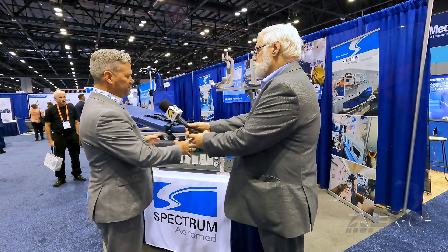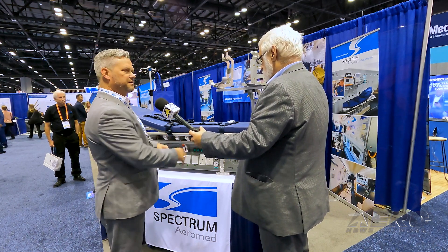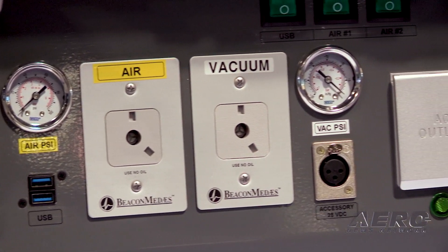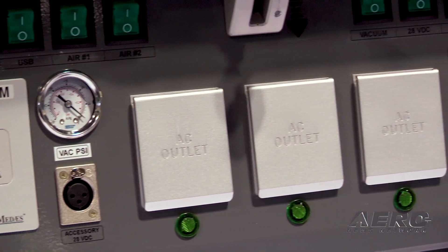The modular system itself is all-inclusive in what it holds. Within this base system you have a 3,500-liter oxygen tank, you have two air compressors, you have a vacuum compressor, and then you have an inverter or a converter depending on what part of the world we're going to. All of that is held within this module base.